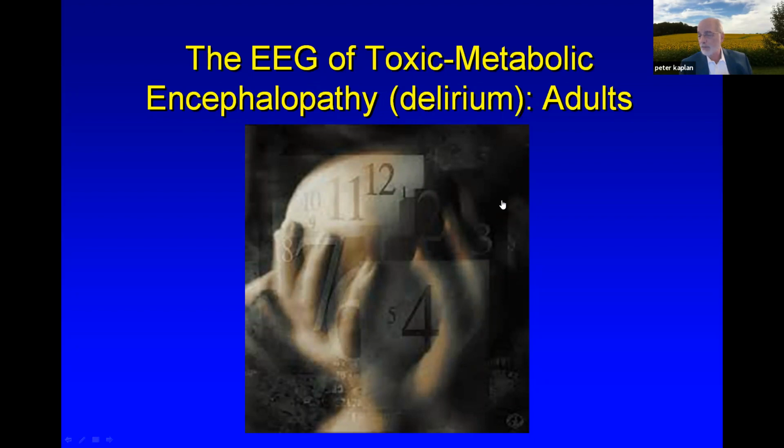Because you can have 2.5 per second with a patient who is actually almost normal and talking to you. And in those patients, I would obviously be reluctant to put them in diazepam or propofol coma. So I go by the clinical level of consciousness, the etiology, and the EEG to decide how intensively to treat the person.